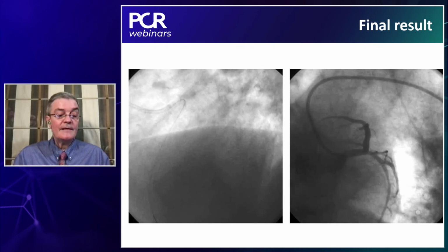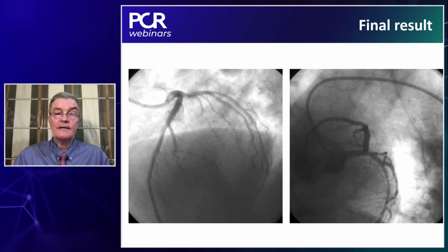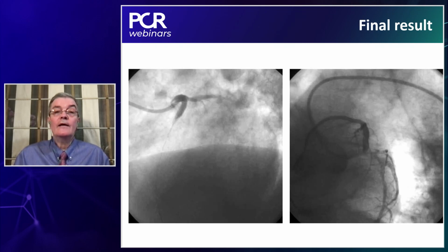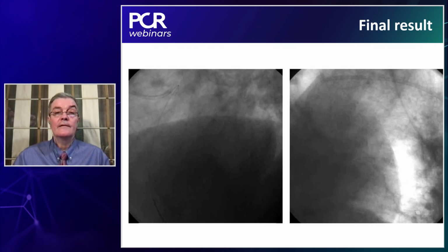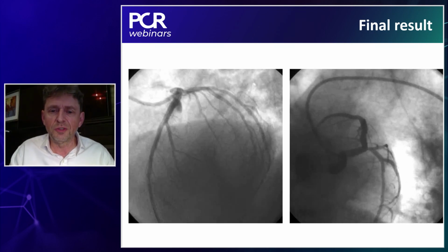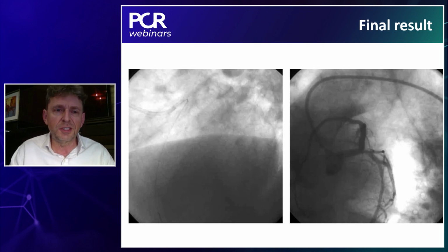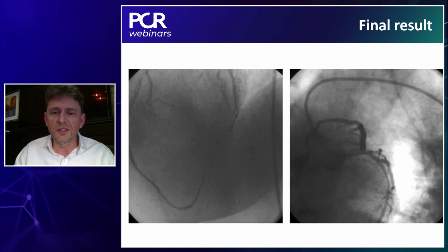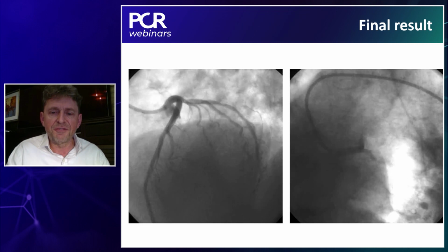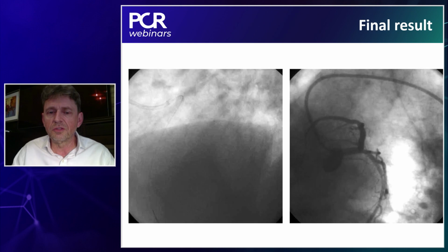Yeah, Dr. Pasca is asking, should we do iFR or FFR to assess functional significance before we proceed with PCI? I mean, anyone can answer. It's your practice. Yeah, as with any lesion, if we are in doubt, we should do this. But keep in mind that if we have a symptomatic patient and single vessel disease, which looks significant angiographically, then of course we don't use FFR. And the second thing is that we are in a setting of acute coronary syndrome.